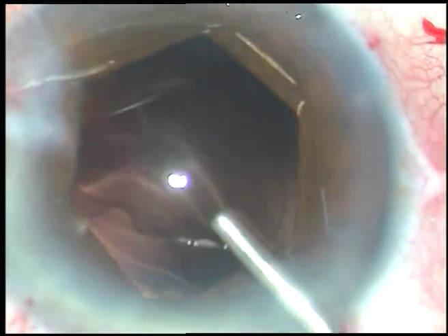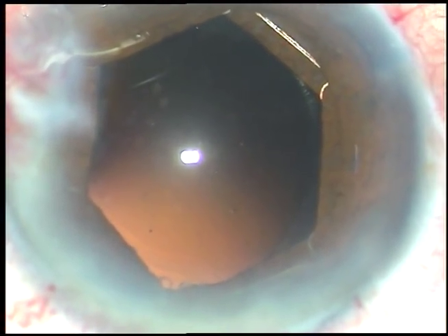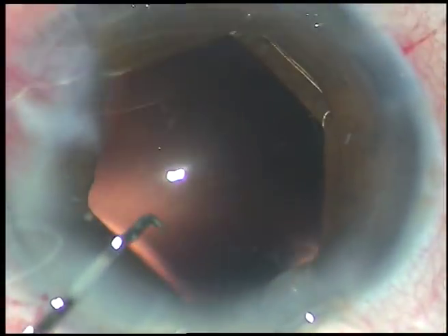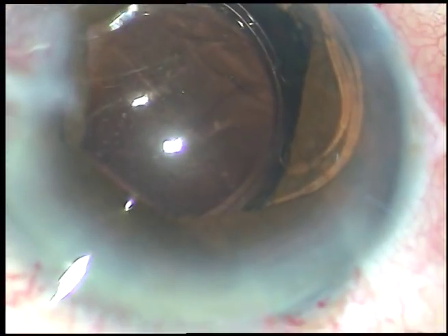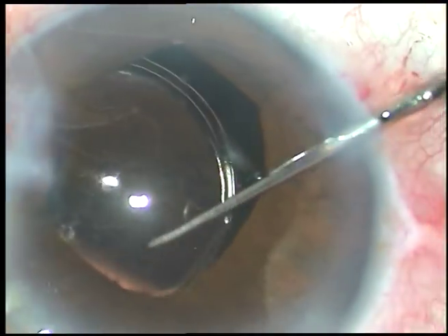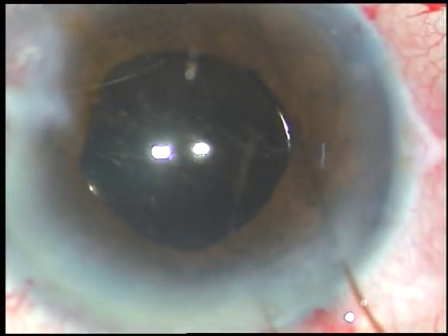Cortical cleanup has been done, which has been edited out. Now viscoelastic substance is injected. See what happens during implantation of the intraocular lens — the trailing haptic will be pushed and that will displace the B-Hex. What we can do is enlarge the main incision a little bit, go into the anterior chamber, and implant the intraocular lens. As I pushed the trailing haptic the B-Hex has been displaced and gone underneath the iris. However, one of the flanges is still in front of the iris and we can hold it and bring the whole device easily into the anterior chamber and take it out.